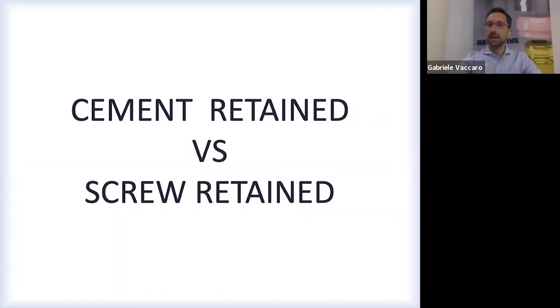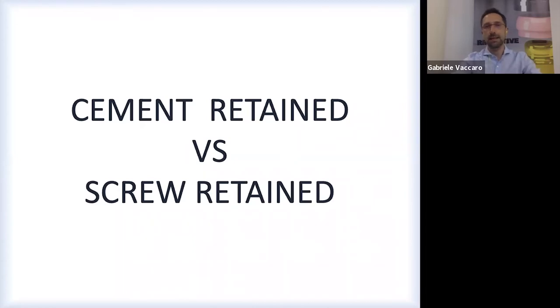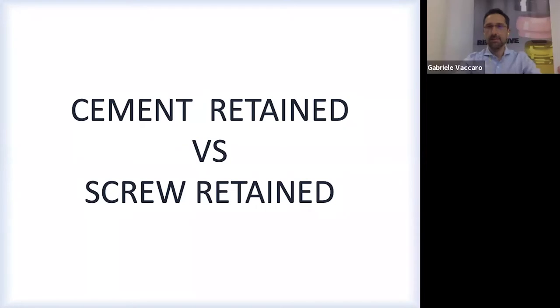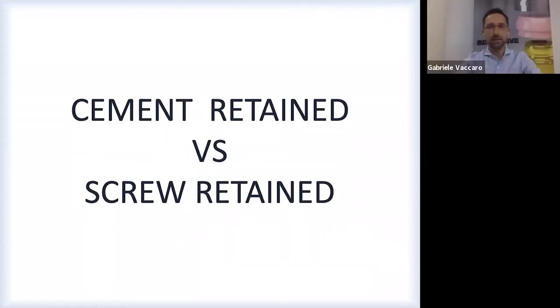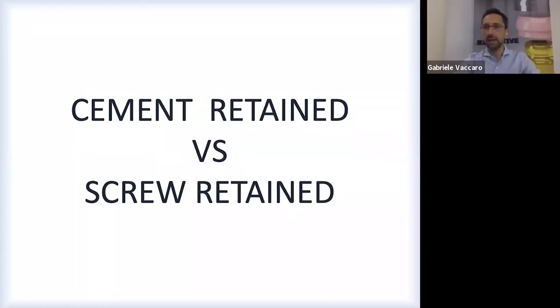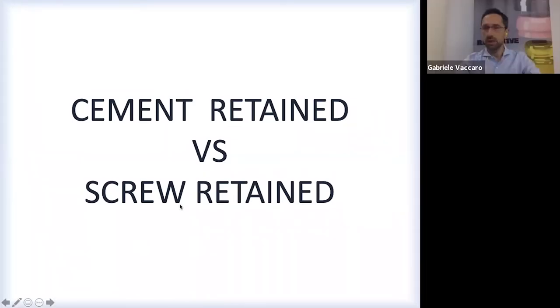Cement retained has, of course, excellent aesthetics, but it has a lot of problems. It's easy to fix some disparallelism issues with the cement retained. But it has a very weak point: when the screw gets loosened, it's almost impossible to remove the prosthesis once it's cemented. The screw retained is more removable when you need it.